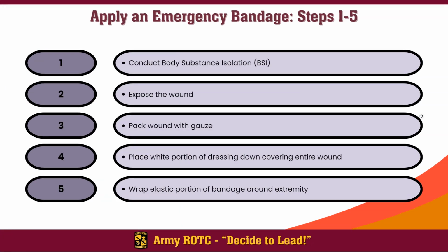All right, so that's hemostatic. And he just said, now it's time for a pressure dressing, which we're going to talk about now. So applying an emergency bandage also has several steps.